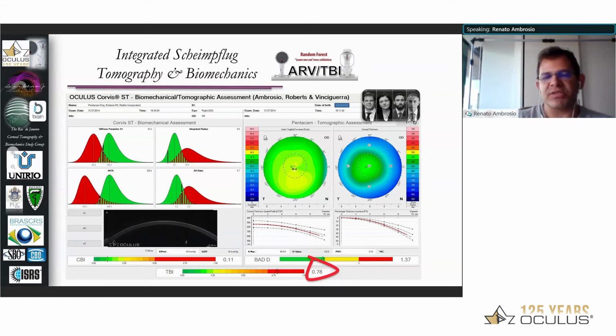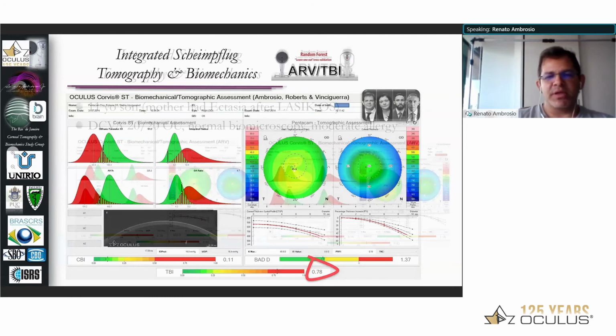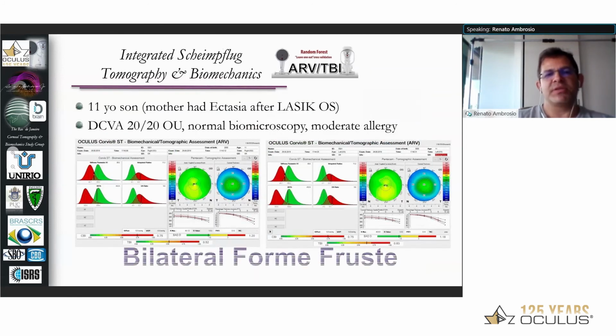She has ectasia susceptibility. Very much of interest is the son of the patient that has this. He has correct vision of 20/20 and a little bit of a possible TKC, a little asymmetric bow tie. But this is the patient that we have to really tell not to rub the eye, and follow up.